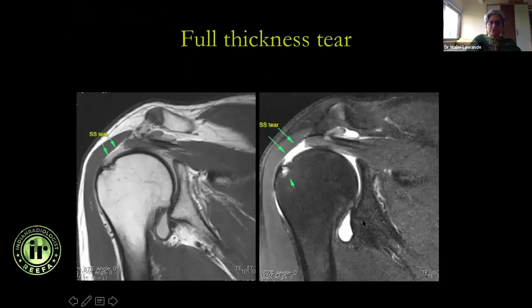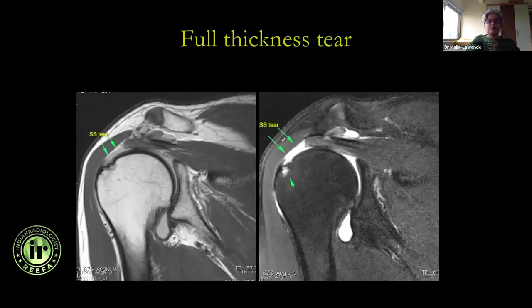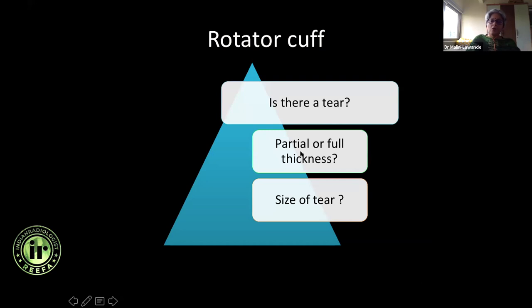Is it a full thickness tear? A full thickness tear is very easy to identify — there's a whole big gap, no tendon remaining at all. We know there's a tear, we know whether it's partial or full thickness. What's also important is to tell the size of the tear.